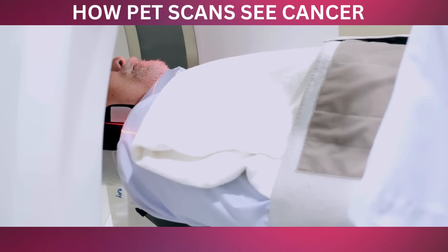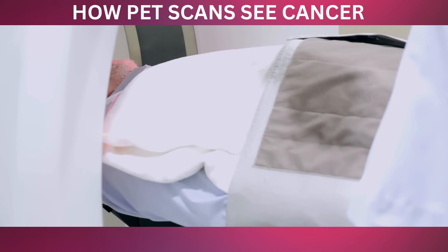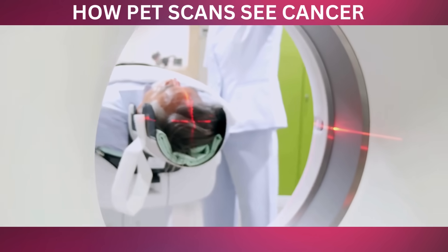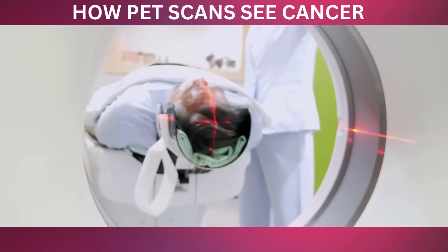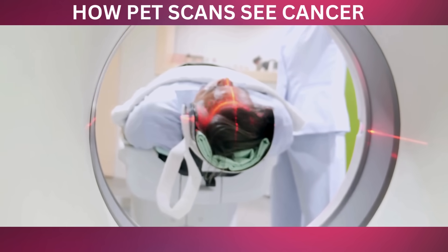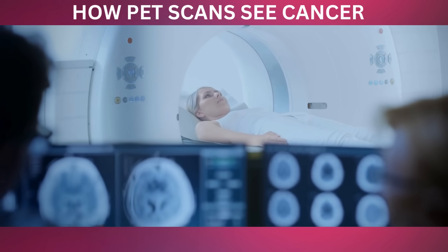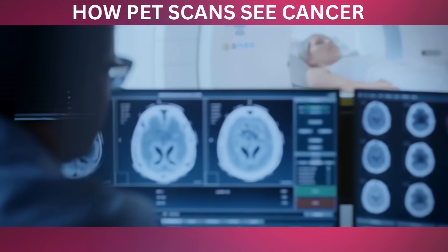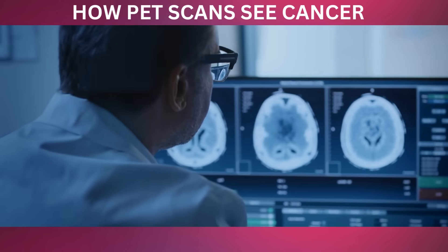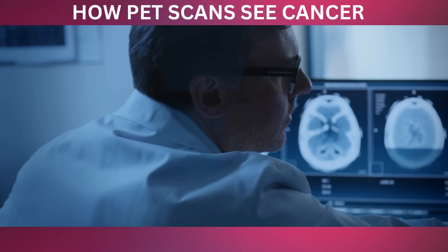If you feel any discomfort or need assistance, you can communicate with the technician through an intercom. Additionally, the room is shielded to protect the technician from prolonged exposure to radiation. Although the amount of radiation is minimal, it's important for healthcare professionals to limit their exposure as much as possible. That's why the technician monitors you from a separate control room and communicates through the intercom to ensure your comfort and safety without entering the room unless absolutely necessary.